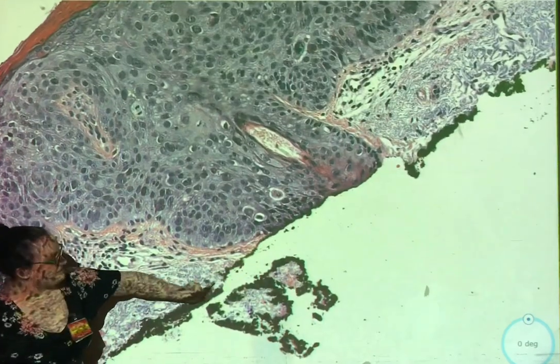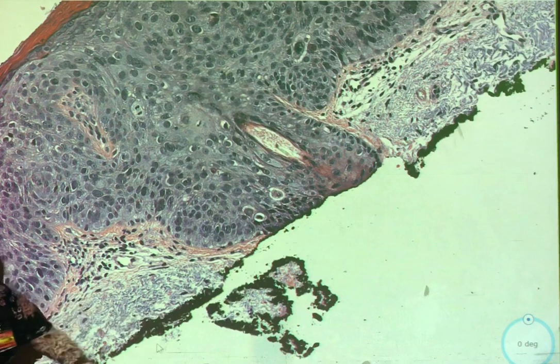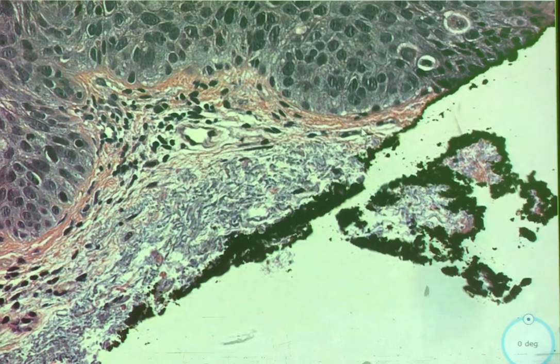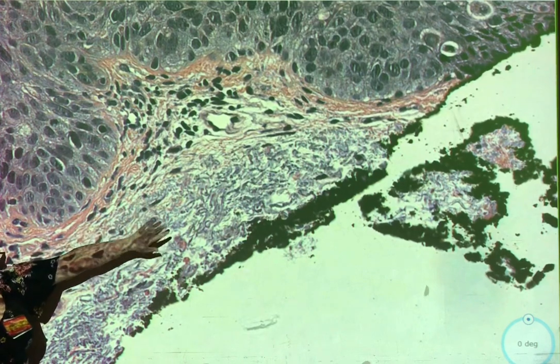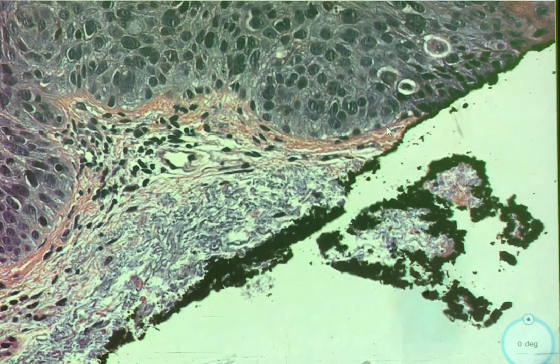So what's this stuff? This is the margin. So that's our ink. And what's on that ink that I was pointing out? Not this stuff. This is solar elastosis. What's right here? What's that? It's already going.